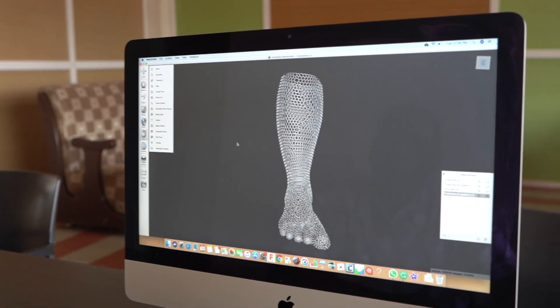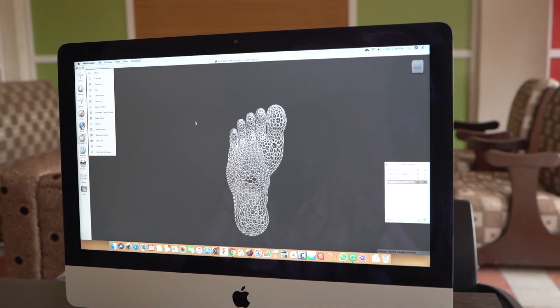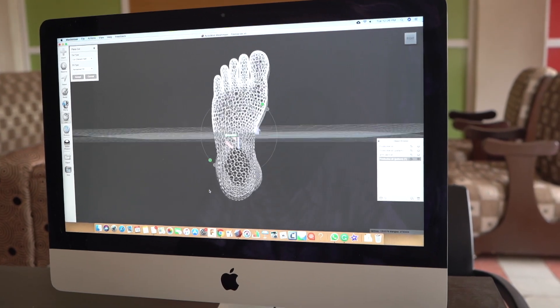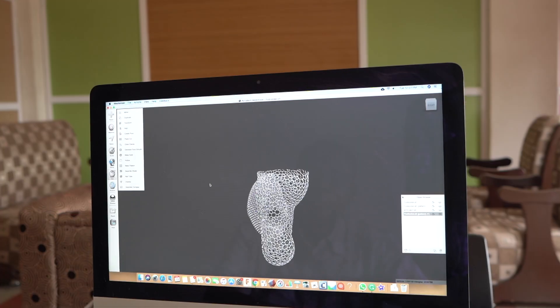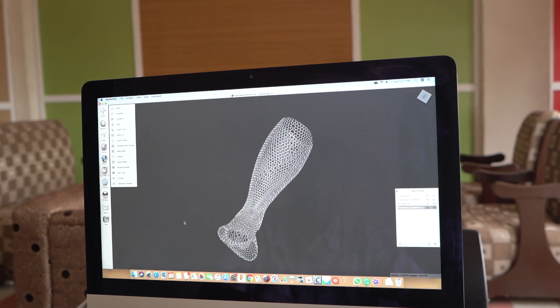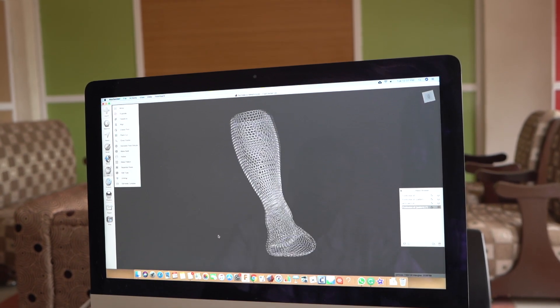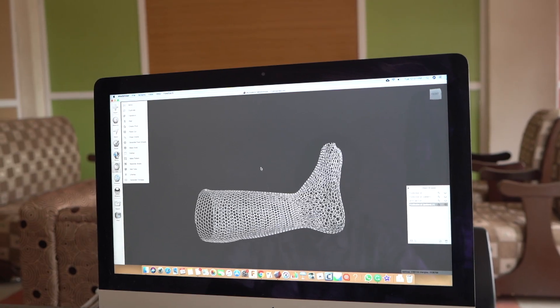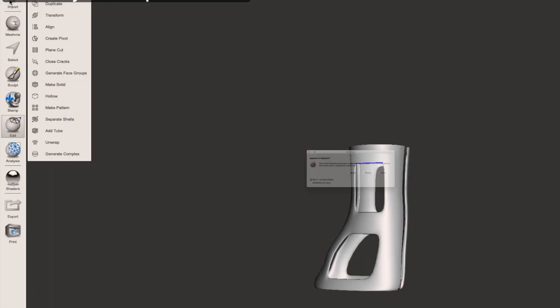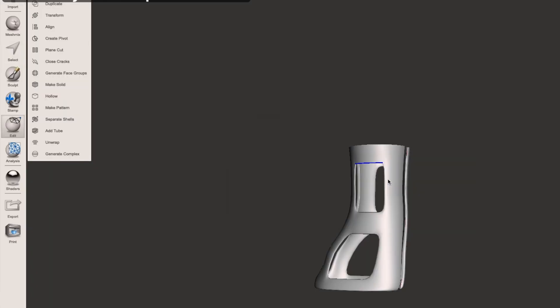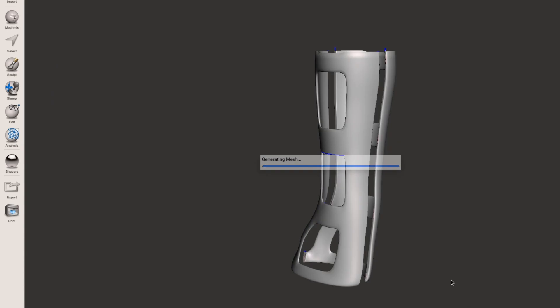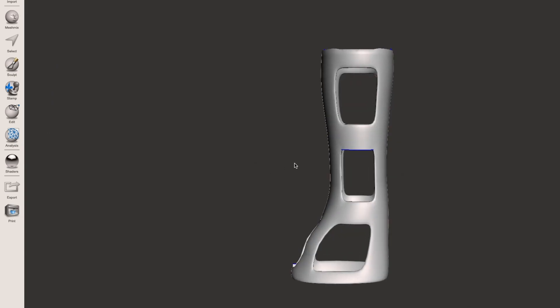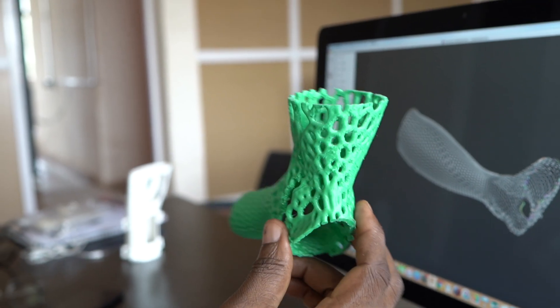Today we're going to focus mainly on 3D modeling, especially in the regenerative medicine aspect of it. We're going to model body parts—the hand and leg. You'll see how we do the modeling. The objective is to replace the common POP cast that is commonly used right now.